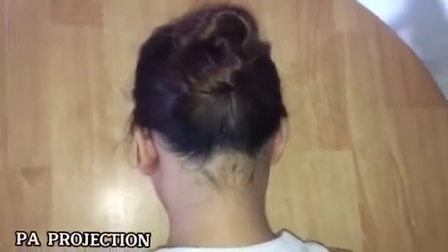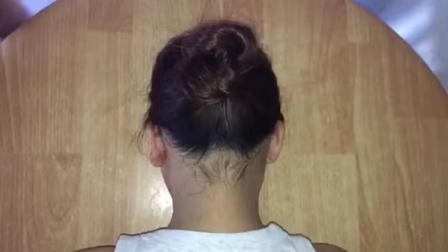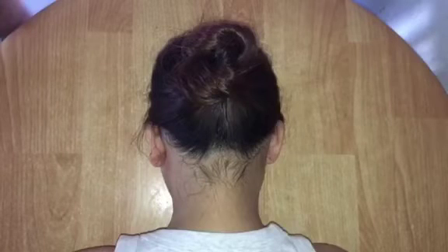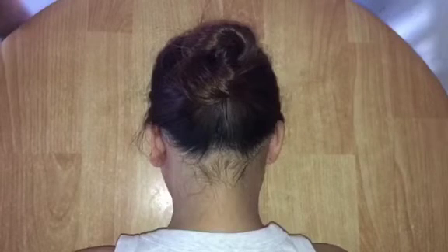So now this is the Sella Turcica PA projection. So the patient is in prone position, forehead and nose against the IR. MSP and OML perpendicular to IR, and the central ray is 10 degrees cephalad to glabella. So the image evaluation is the dorsum sellae, tuberculum sellae, anterior and posterior clinoid processes seen through the frontal bone above the ethmoidal sinuses.